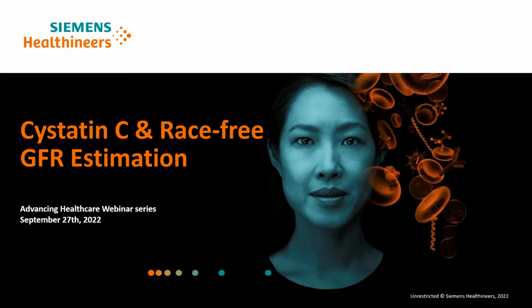So let's get started. Our first question is for you, Dr. Karger. This question says, you mentioned that Cystatin C is traditionally performed on immunoassay instruments, but more recently manufacturers have made versions available on clinical chemistry instruments. Could you please discuss some of the differences running Cystatin C on these different platforms?